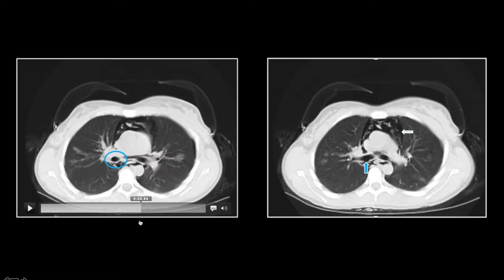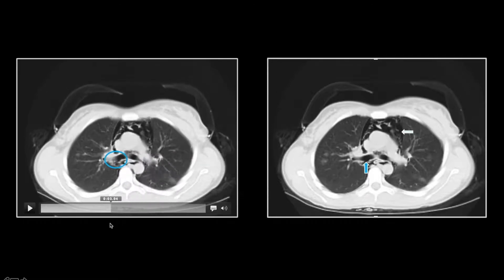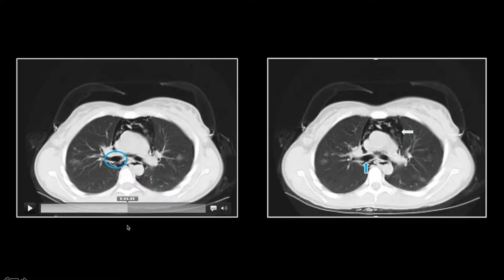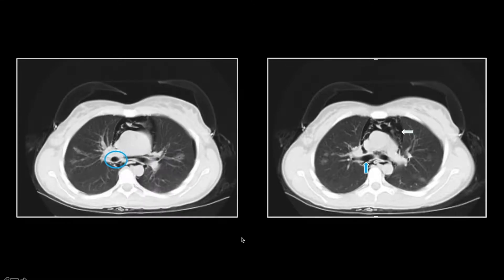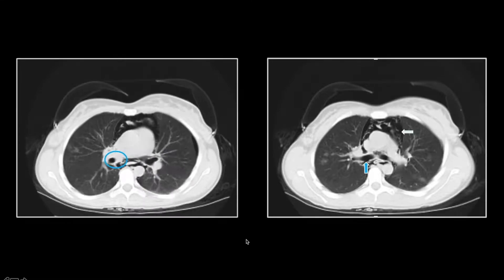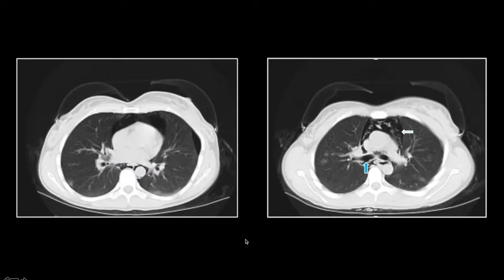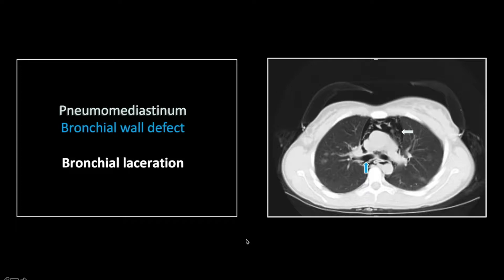The direct visualization of a bronchial laceration such as this was an unfulfilled dream for many radiologists of my generation, and to see them this clearly on modern CT scans is truly a remarkable experience. So that is a case of a bronchial laceration.